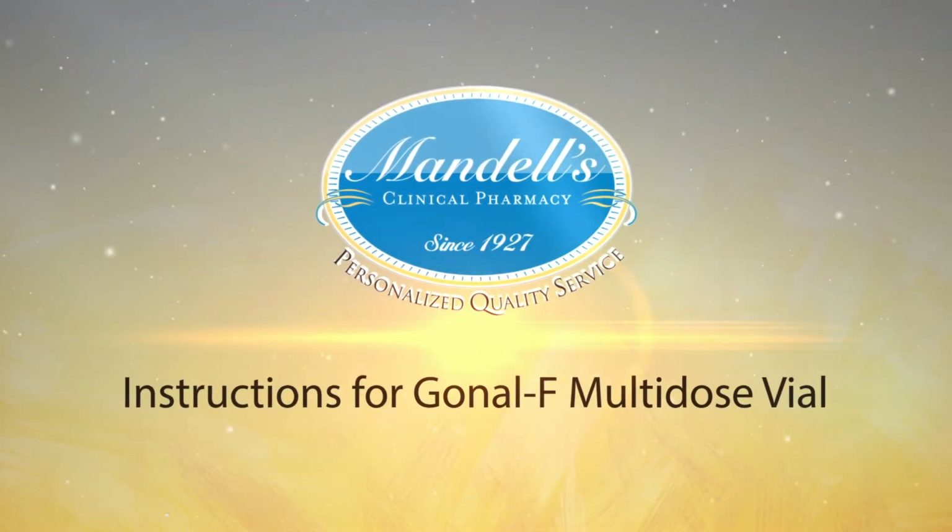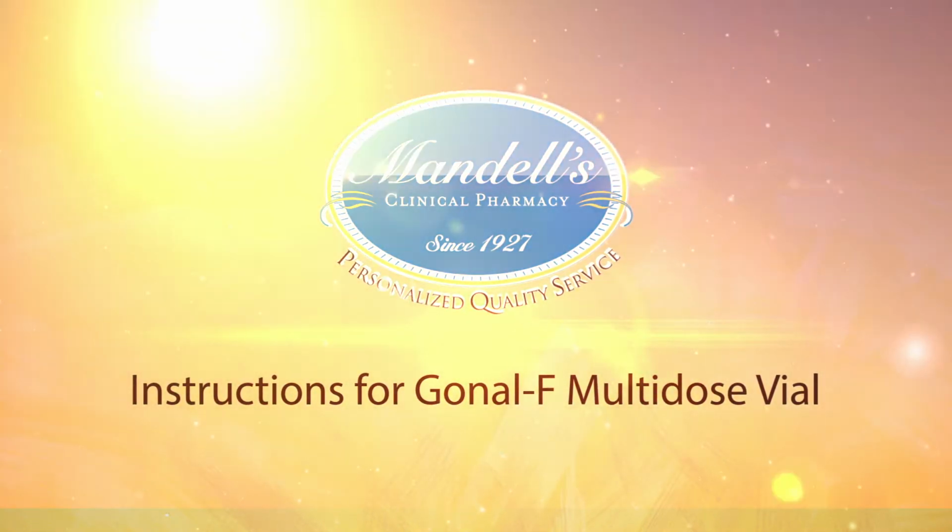This video is to help you with the multidose Gonal F with mixing and administration. If you've been prescribed multidose Gonal F, it is an FSH product, follicle stimulating hormone. So you're taking that product to actually stimulate the ovaries to produce multiple follicles, which in turn produces multiple eggs, preparing you potentially for egg retrieval or even an intrauterine insemination.